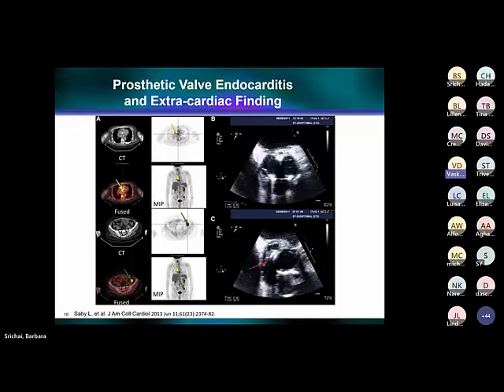Next slide, please. Now, here's a very nice patient example of where the relevance of FDG PET-CT can be. In the yellow arrow, you can see very hot area where the prosthetic valve is, and clearly this is the site of the infection. Again, you could have made this diagnosis perhaps with echo or perhaps with CT. But the advantage of PET is that when you look at the entire body, you see in the abdomen, in the left lower quadrant, intense uptake with the green arrow, which tells you that this patient has adenocarcinoma of the colon. And by the way, that is the nidus of the infection for the valve. So if you don't make that diagnosis, obviously it doesn't help you to replace the valve because it's going to have recurrent infection. So again, the beauty of FDG PET-CT is that not only can you identify the primary perhaps source of the infection, but also the embolic sources as a consequence of the infection.